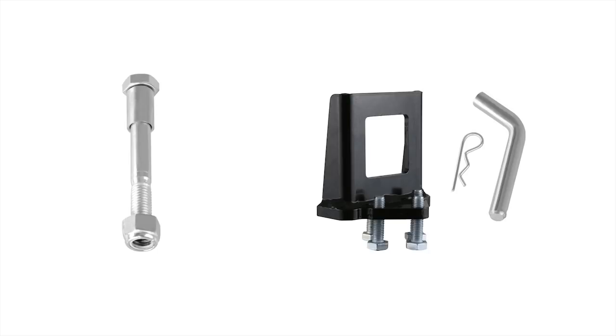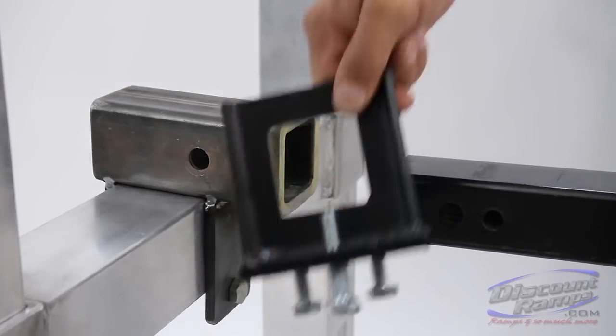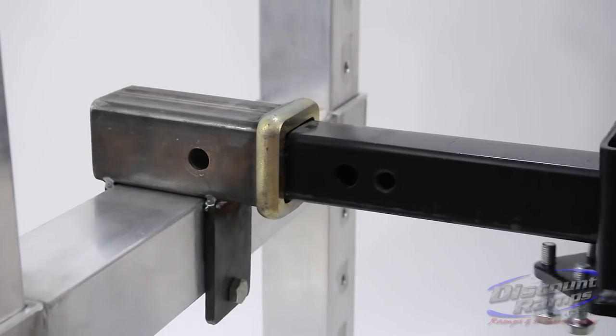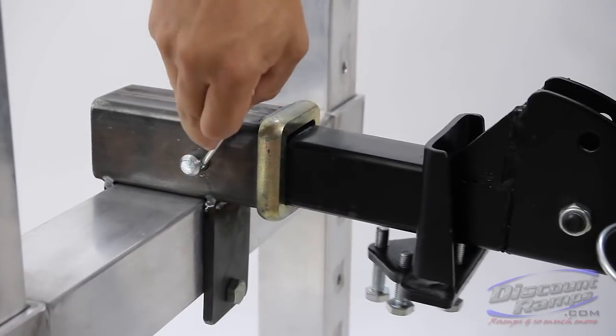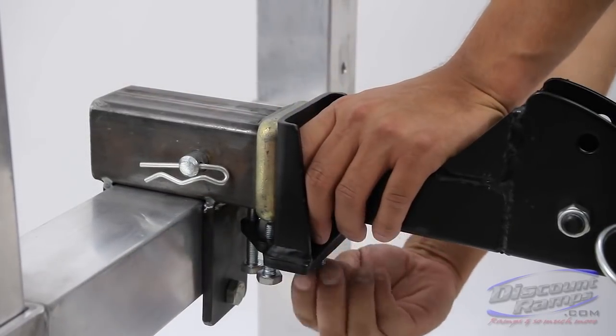Parts needed for installation include pinch bolt and/or anti-tilt locking device and hitch pin. Slide the anti-tilt locking device onto the carrier hitch tube with the three bolt side facing the hitch. Now install the hitch pin and slide the anti-tilt locking device tight up against the hitch receiver. Fully tighten all bolts.